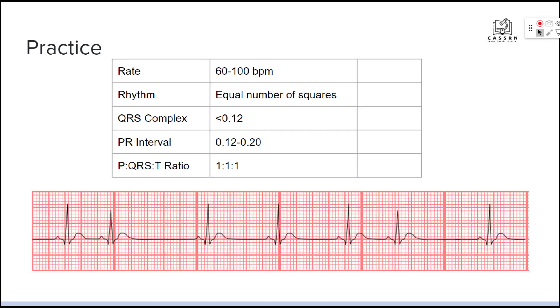Let's go through some practice. Before we get too far into this, understand that PACs are going to have an underlying rhythm — you can't have PACs alone. If you tell someone the rhythm is just premature atrial contractions, they're going to look at you funny. We need to identify the underlying rhythm first, and then we can say something like normal sinus rhythm with PACs, or sinus bradycardia with PACs, or sinus tachycardia with PACs.